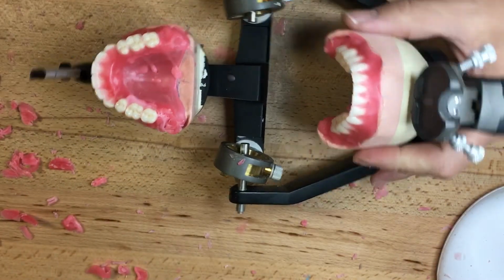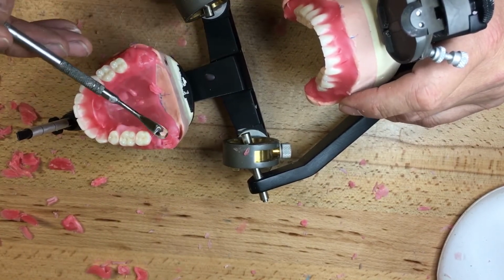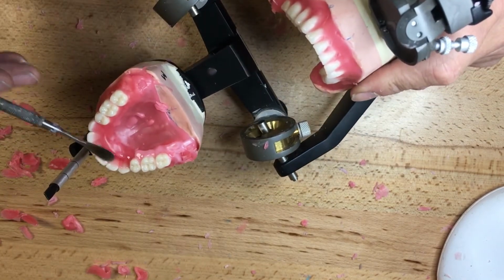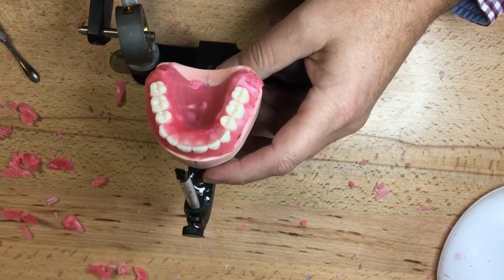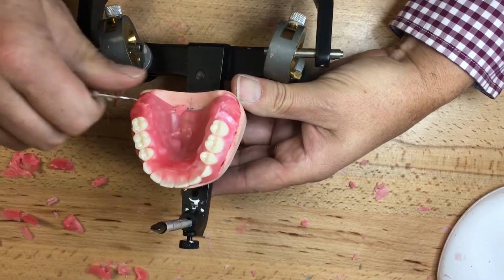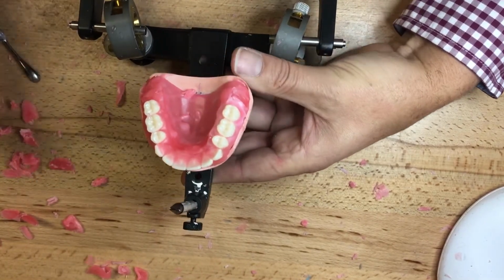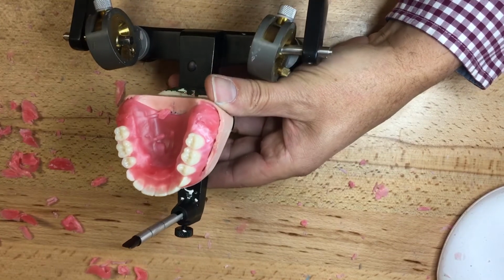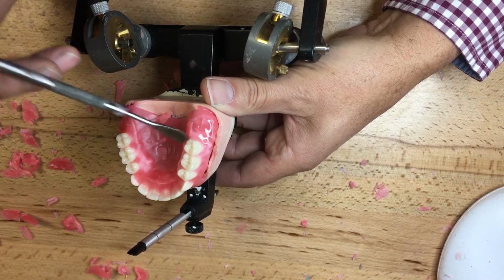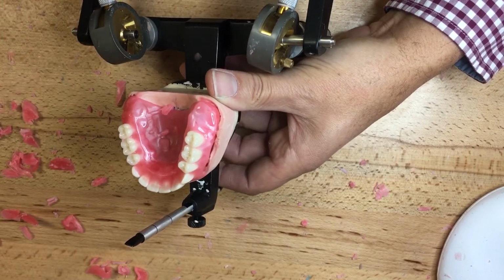A little too soon to check excursive movements because the wax is still in a molten state. I'll just push the teeth around. I'm going to wait till it solidifies just a bit. So what excursive movements am I going to check? Protrusive, that I have tip-to-tip contact in the posterior section and in the anterior section. They are incisal edge to incisal edge. This increases denture stability. I think this is a common thread through all denture occlusal philosophies, that we have group function, that we have balance, with 3-point contact.